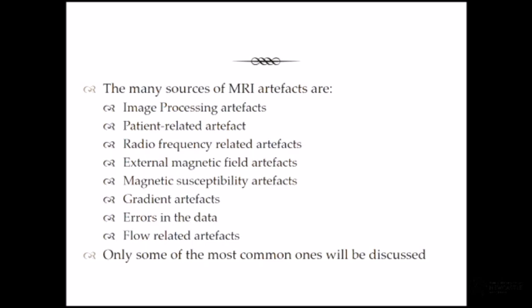External magnetic field artifacts. One of the things that we think about when we put an MR scanner in is siting. We really want to put our MR scanner in a facility, in a hospital, in a private practice, away from moving metal. So we think about things like elevator shafts and access to car parks, so that we don't have that influence of metal moving in the fringe field.